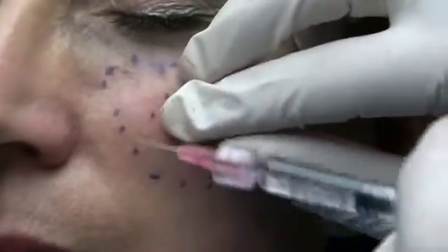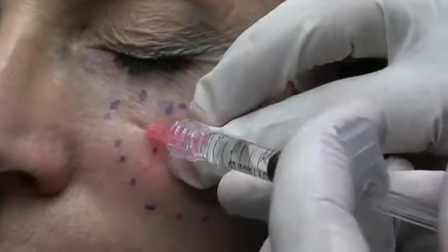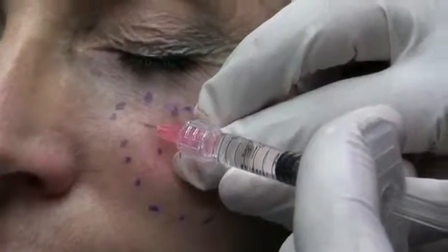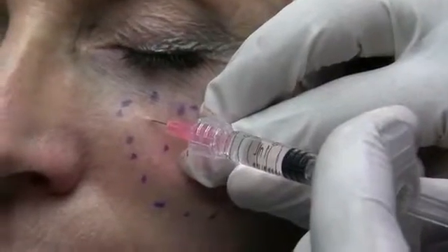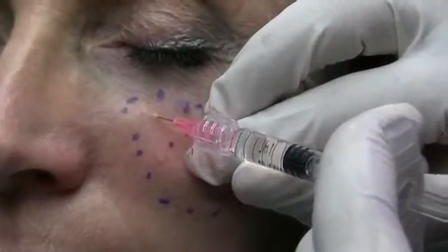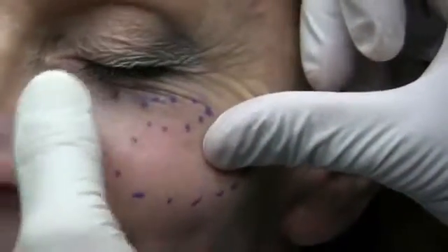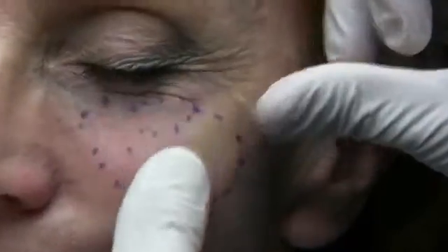You can see how nice that is looking here, a little pinch. Got the angular artery in this area and the infraorbital neurovascular bundle. Yes, you do. And that's a really nice correction here, although she feels it.